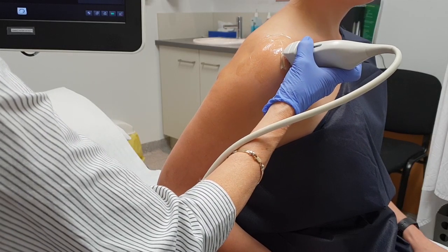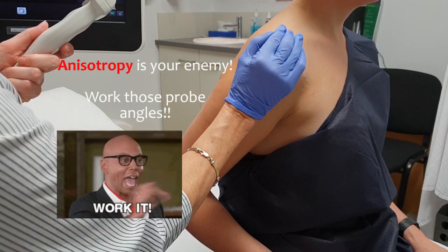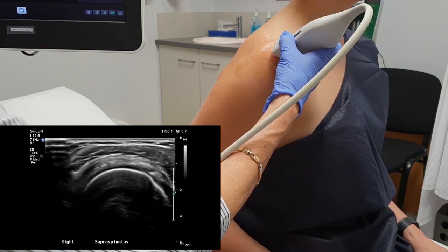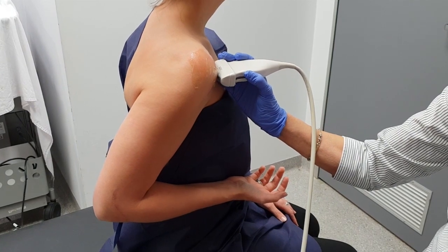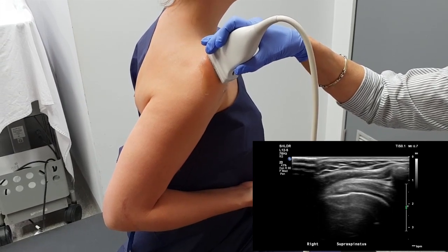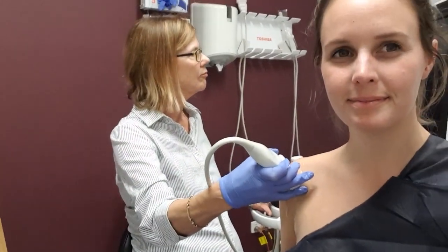I always start in transverse when I'm doing my supraspinatus — that's mainly so that I can see the landmark of the biceps easily. Remember, it's a curved joint, so you're looking at a curved tendon. Make sure you come all the way out to the insertion because it's at that insertion where you will see the enthesiopathy, and insertional tears are very common. I start by finding the biceps tendon in long — anything behind that biceps tendon has got to be supraspinatus. You work increment by increment to see the tendon. When you get to the mid part of the tendon, you should have the landmark of the acromion at the edge of the screen. That allows you to assess whether the tendon is thick and whether you think it's going to impinge when you abduct the arm.